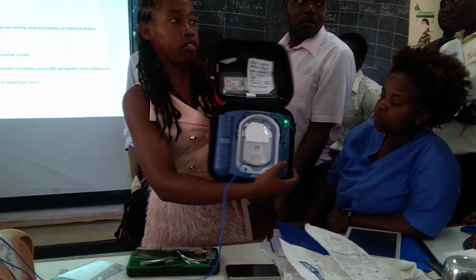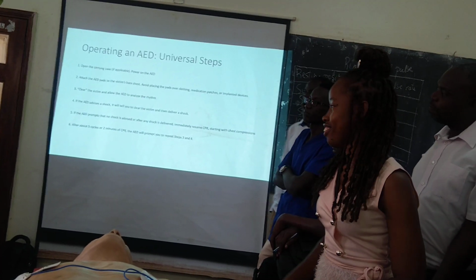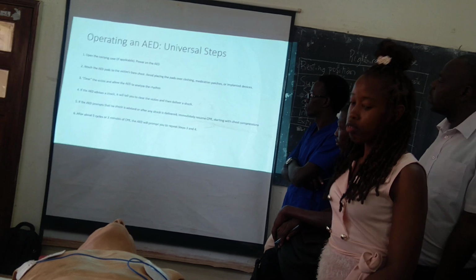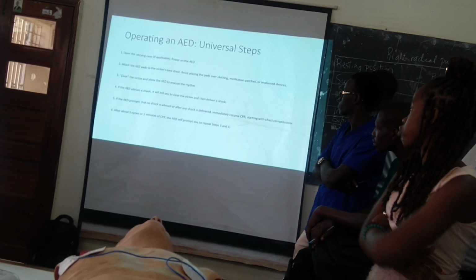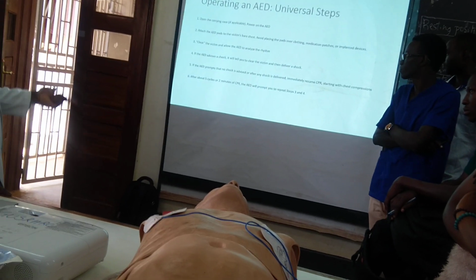Ignore whatever the machine is saying. We are coming to number 5. If the AED prompts that no shock is advised, or after any shock is delivered, immediately do what? Resume CPR, starting with chest compression.